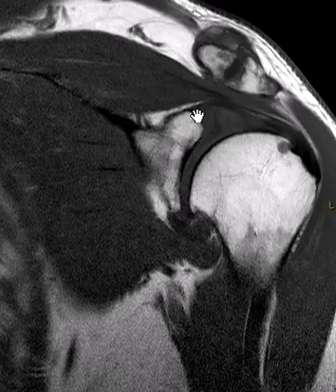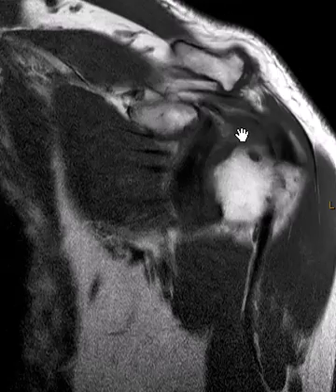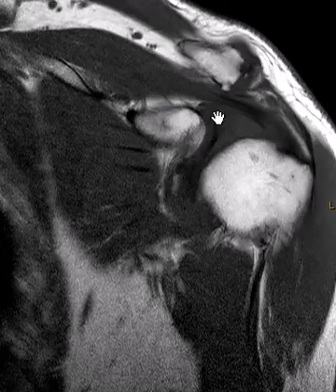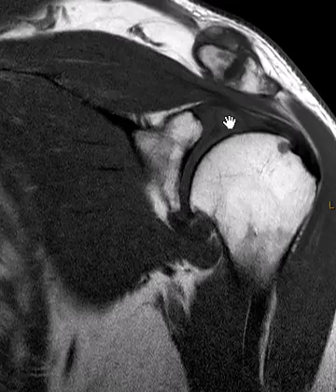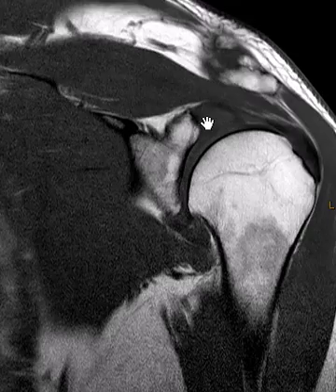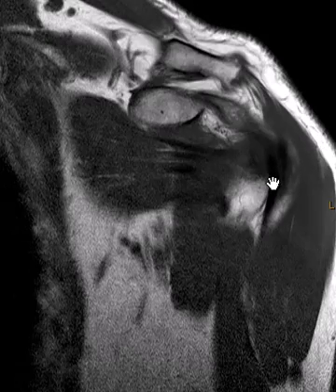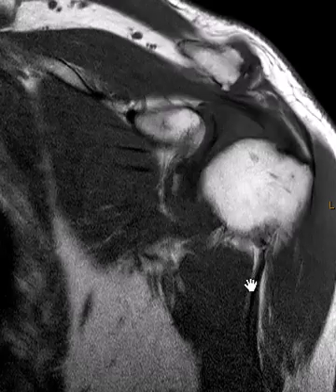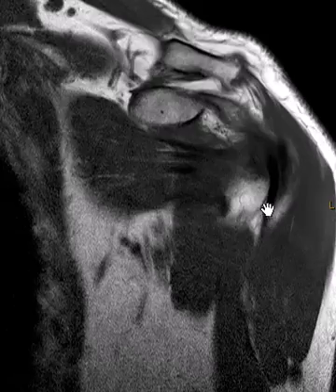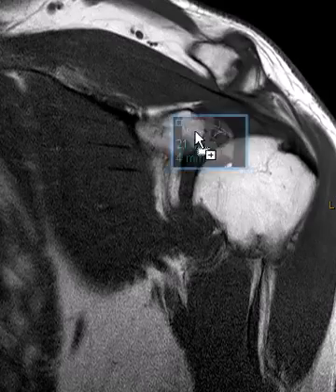The main finding was right here — that superior labrum and the biceps tendon, the intraarticular portion of the biceps tendon which is right here — both were really expanded and have a lot of increased signal. Down here is the biceps tendon; within the groove it looks normal, so it's just the intraarticular portion that's expanded.